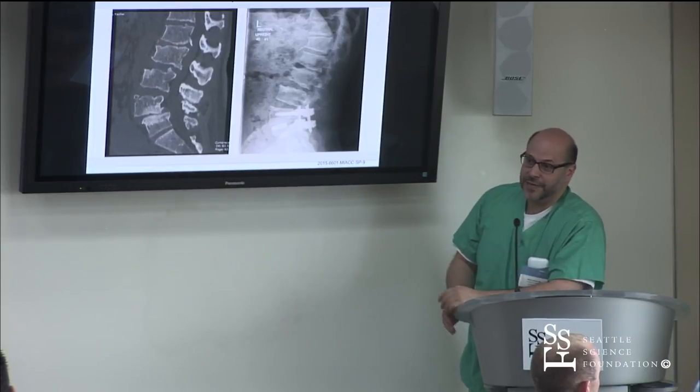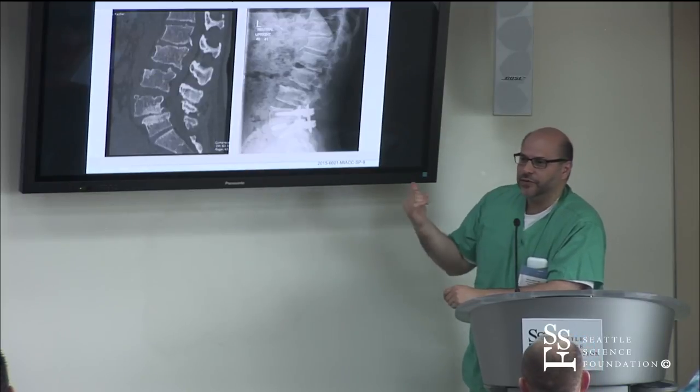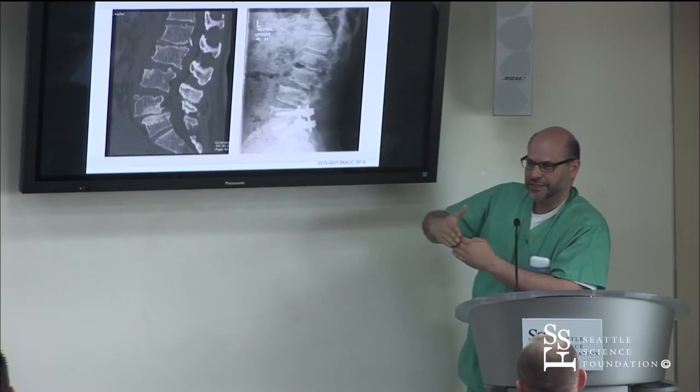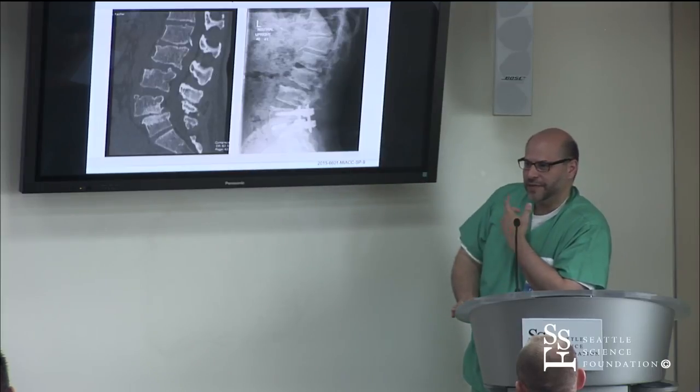I haven't had to do that in a long time, but sometimes when they're really stiff, you kind of have to. But I found that most of the time they get up enough, and again, you don't need to jack her up to a 12 or 13 disc space. You just need to get the pressure off that root and get that foramen to open up. So I've been able to do that usually.